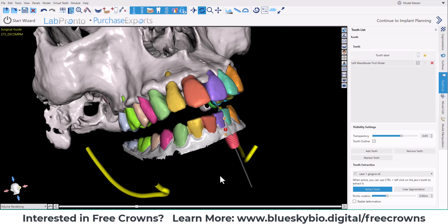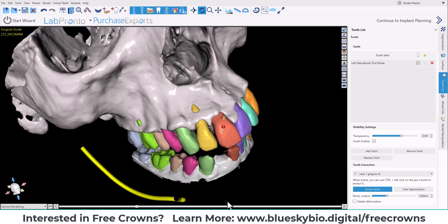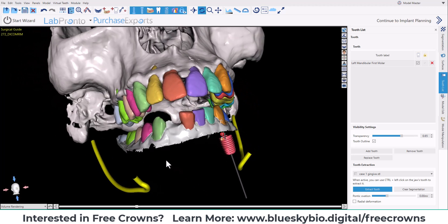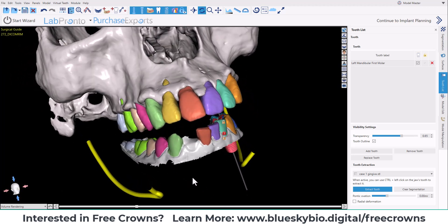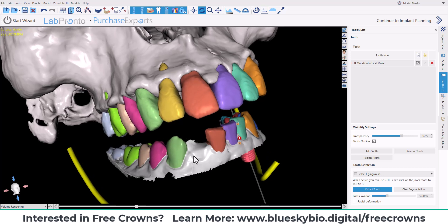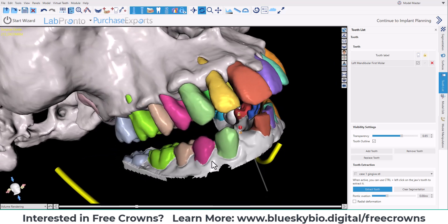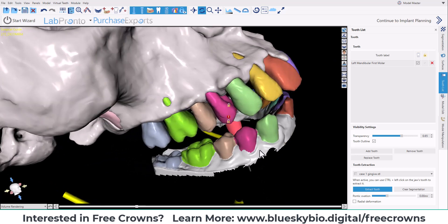As indicated on screen, use CTRL plus left click to remove a tooth. With a single CTRL+click, the tooth is gone. There's no remaining hole — the hole has been closed. We can do it again: CTRL+click, and the tooth is gone.